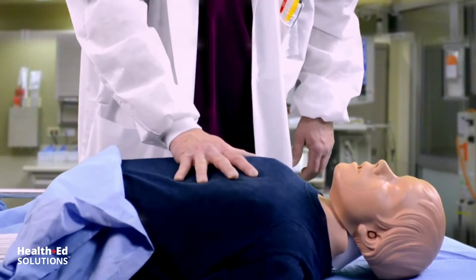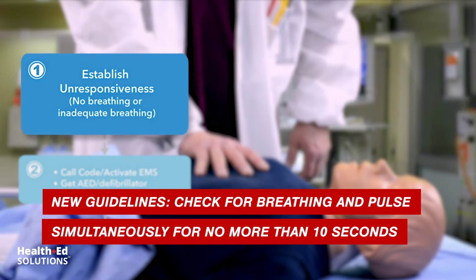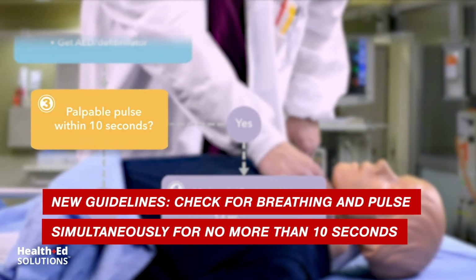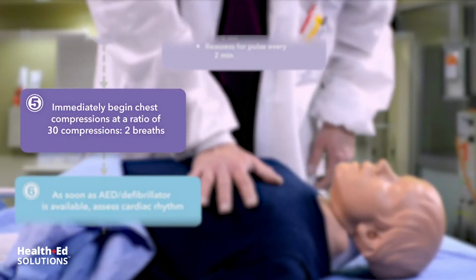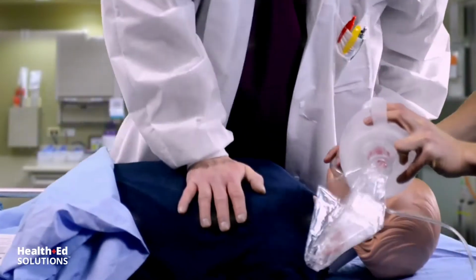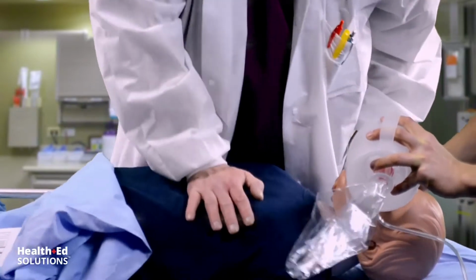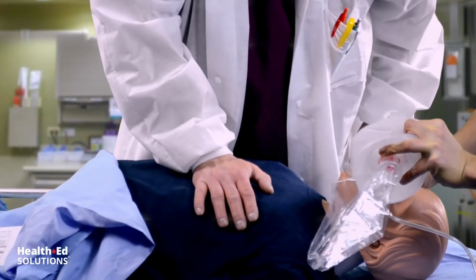Hey kid, you okay? This kid's unresponsive. He's not breathing. Nurse, call a code. Hey, this kid doesn't have a pulse. Hey, get over here with that AED. I'm starting compressions. And go right to 15:2.